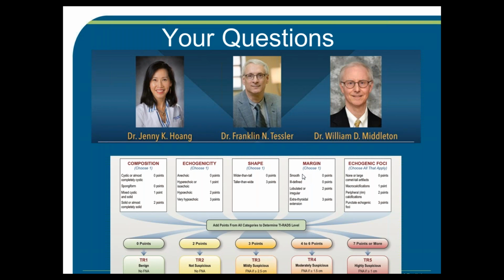What I do in those cases is look for any nodule that stands out by virtue of its ACR TI-RADS classification. If there are multiple nodules that are similar and relatively low in suspicion, say TR3, and they're scattered throughout the gland, I typically just recommend follow-up for those. I don't think there is any value in just biopsying the largest nodule simply because it's larger than others. The problem in glands like that is that there is a lot of room for sampling variation. How do you pick which one to biopsy? Again, the way to do that is how it compares to the other nodules in the gland. But I understand those are difficult to deal with. In fact, those glands make it really hard to measure nodules because they're often confluent and it's difficult to see their borders.